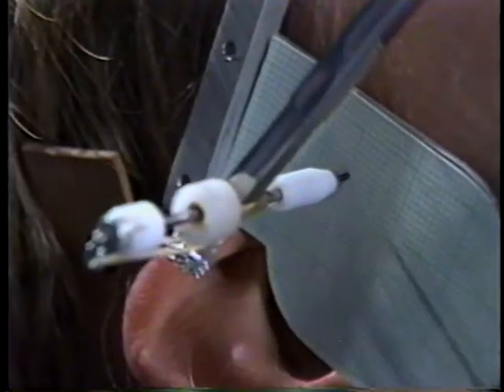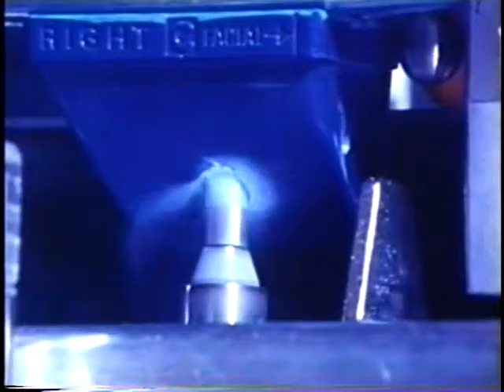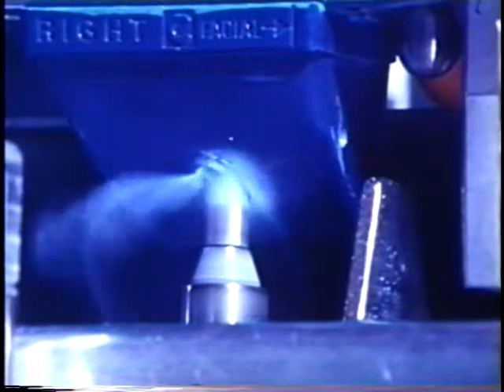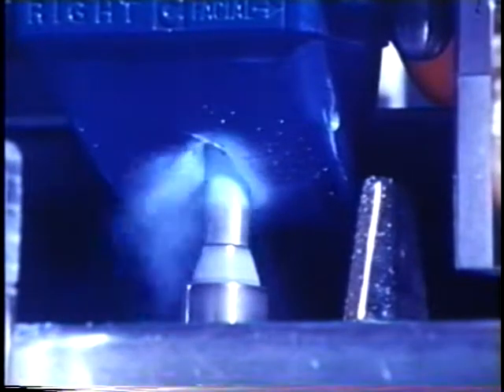Dr. Robert Lee, a California dentist, developed a condylar movement recorder that used air turbine drills to engrave a subject's condyle movements in clear plastic blocks. The drill is recording the non-working condyle movement, which was previously demonstrated by other methods. Dr. Lee also developed a method of directly transferring the condyle movement pattern of the patient, which was engraved in the clear plastic blocks, into milled articulator controls.